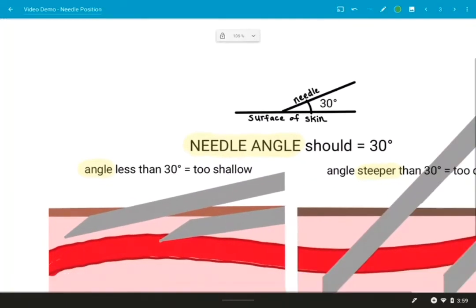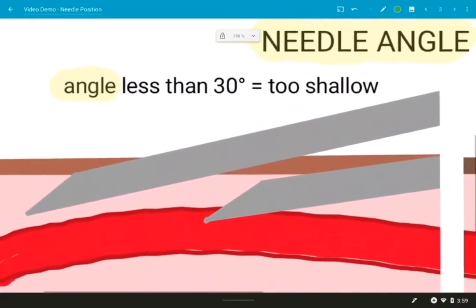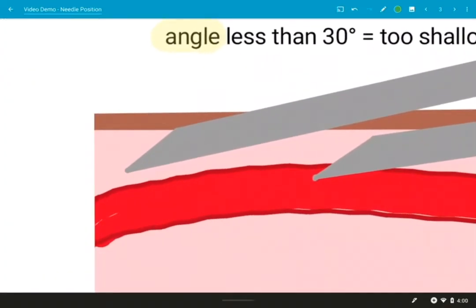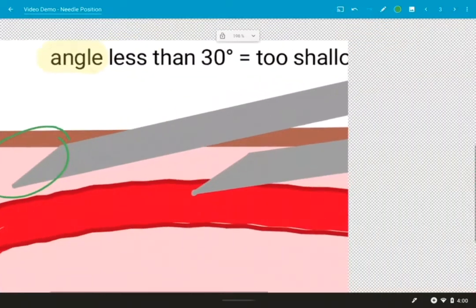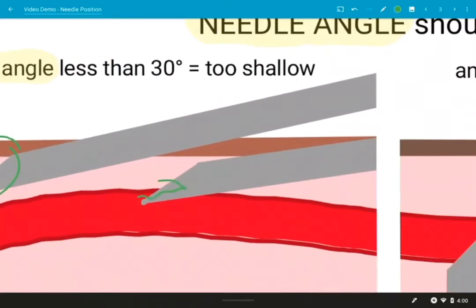Just a note that some veins are going to require a more flat approach than others. But you really want to make sure that you have that angle correct. Inserting a needle at less than 30 degrees is going to make it too shallow. So we run into the same problem where you miss the vein or you create a hematoma.